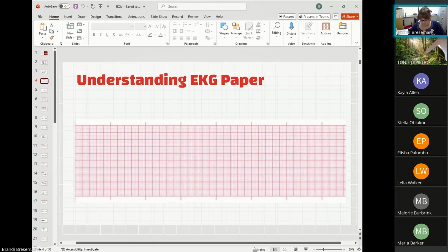And I stabbed myself with them. I had a little card that I used to carry around with it all the time because technically the way we're going to show you to count heart rhythm is not completely accurate. So there was a little card and it said if I had so many blocks between my R and R, this is what my heart rate was. You can tell this is pretty beat up.